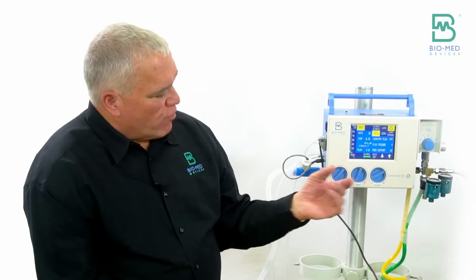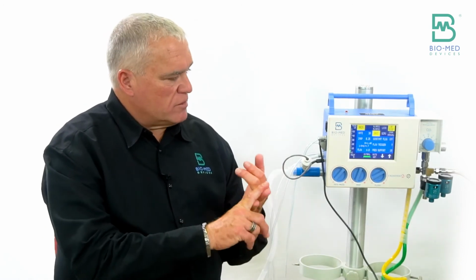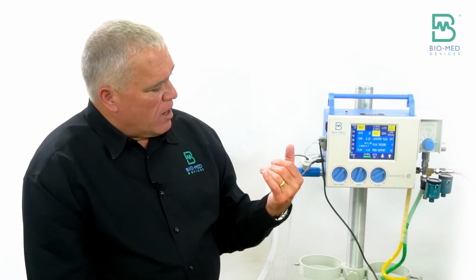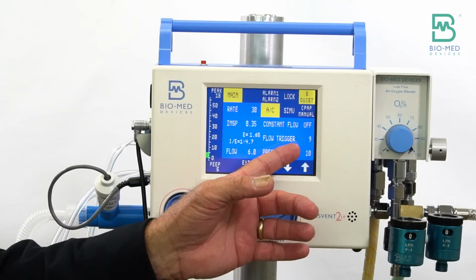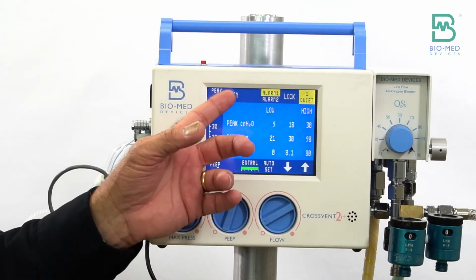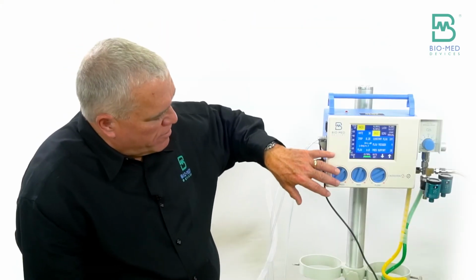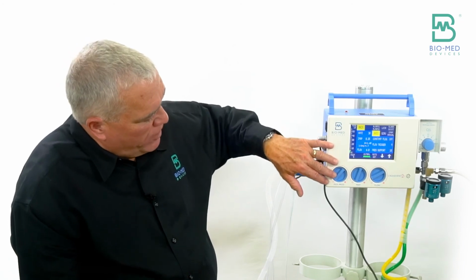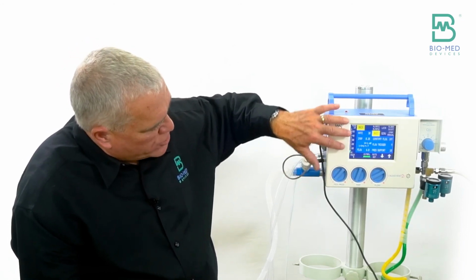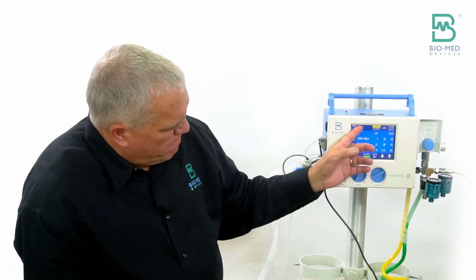So before I would blurt out that number, I would say, well, we have a good heart rate, we have a good sat, but we have a big leak and I'm only getting 8, 7.9. That way, hopefully they're not going to just think that they need to get 14, because they might dial that pressure up. So anyway, keep that in mind in reference to leaks.